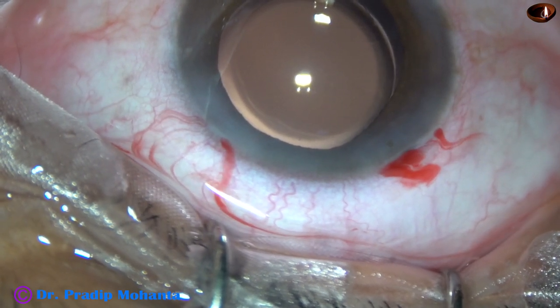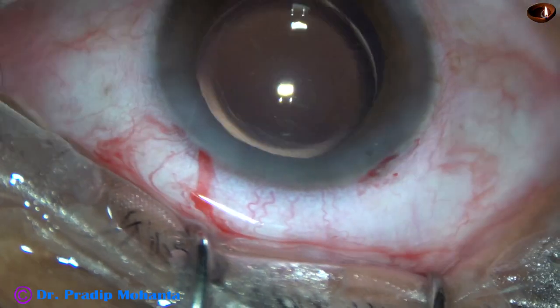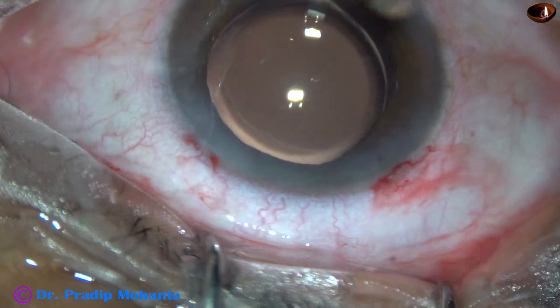Integrity of all the wounds are checked — there should not be any leakage from any wound. Then, a few drops of moxifloxacin is applied over the ocular surface, and the case is concluded.